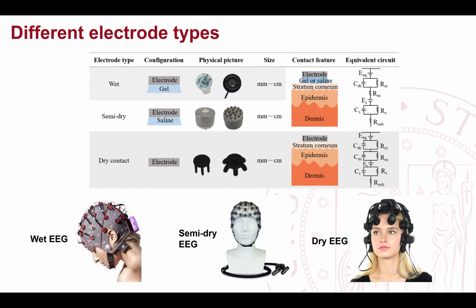We asked them to stay, and we reduced the minimum number of electrodes. So we only focus on the central area because we are interested in the motor part. And so we try to reduce the number of electrodes to prepare to the minimum possible, so that it takes like 1 minute to place all the channels and that they are good to go. Because if you have to place like 64 electrodes while the child is seated, you have lost the attention and it's done. Okay. So again, it's a matter of compromise.